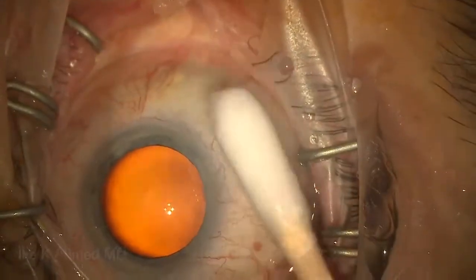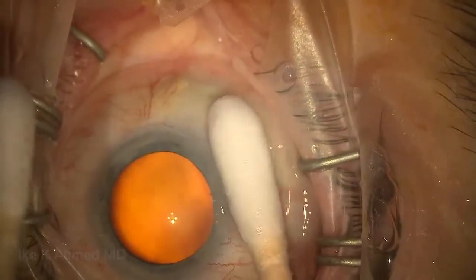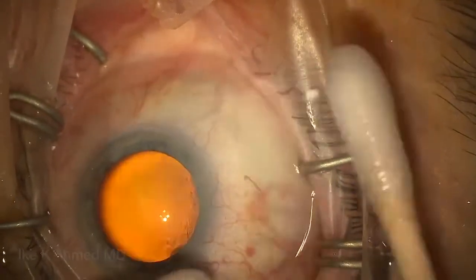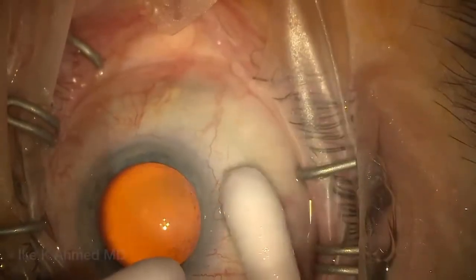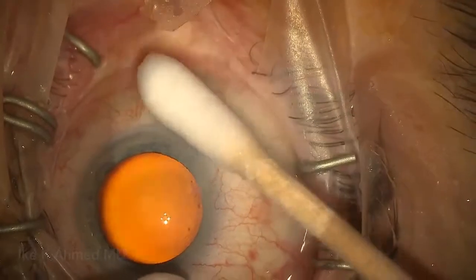The goal here, of course, is to create a more posterior bleb, and the area of application is in the supranasal quadrant, which will be the area where the Zen will be intended to be implanted. Having the patient look down again, rotating the q-tips to keep the mitomycin away, and usually waiting about a minute or so prior to making incisions.